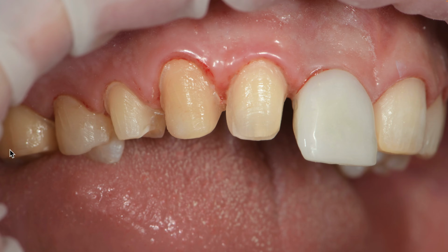Veneer, crown over here. Again, my posteriors, full contour zirconia crowns, I go pretty much pushing the envelope on the design. I'm not putting a big shoulder. I'm putting a pretty minor chamfer, medium chamfer all around it, and trying to give enough occlusal reduction. But we're going to use a stronger zirconia on the molars, and they'll be full contour. So I've not had, knock on wood, a problem with these cracking, even though I'm pushing the envelope of how conservatively I'm prepping a full contour molar zirconia crown.